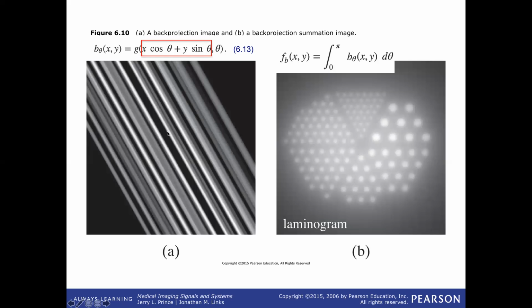So I have my projection along here, and what it means to do this back projection, with a more complex object and many more of these signals, is that I create a two-dimensional picture, B of theta, X, and Y, from this one-dimensional G of L and theta, by mapping the same value along the direction orthogonal to the detector. That mapping is done quite simply by this. So now I have X and Y values.